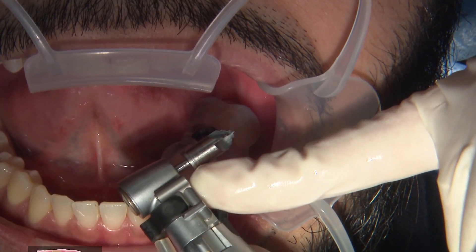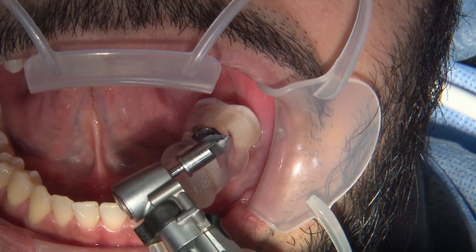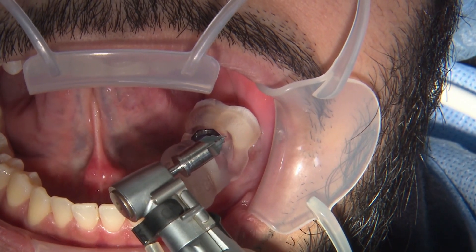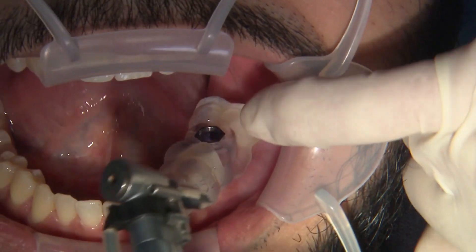You can see this little flange here on each of the drills — we talked about this before. You really don't have to worry about any depth guidance; all of that is worked into our calculations. So as you drill, you can just push the drill all the way down until it bottoms out.